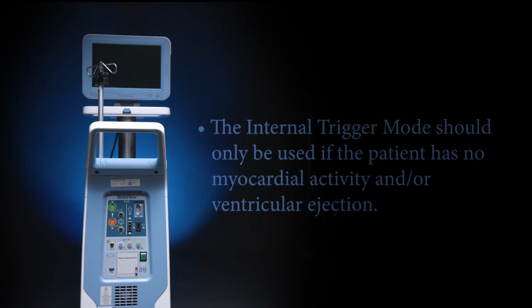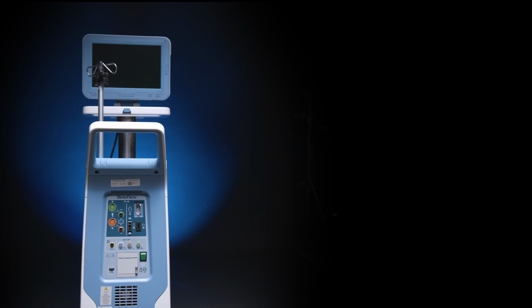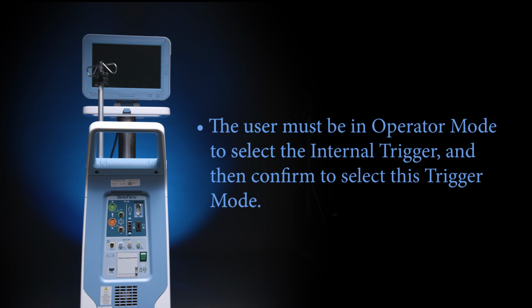Note, the internal trigger mode should only be used if the patient has no myocardial activity and/or ventricular ejection. The user must be in operator mode to select the internal trigger and then confirm to select this trigger mode.